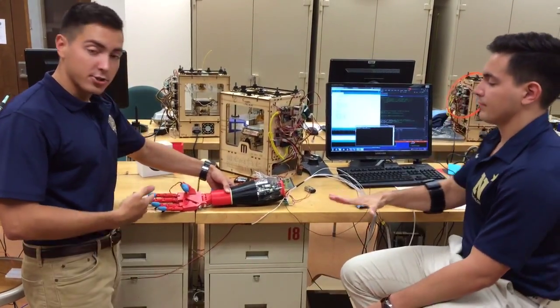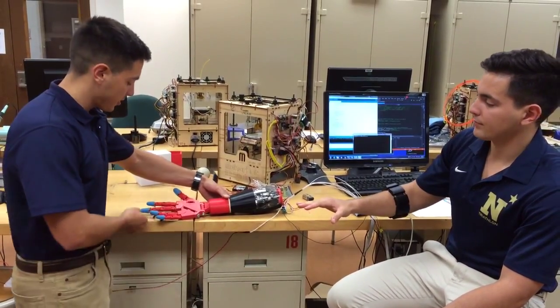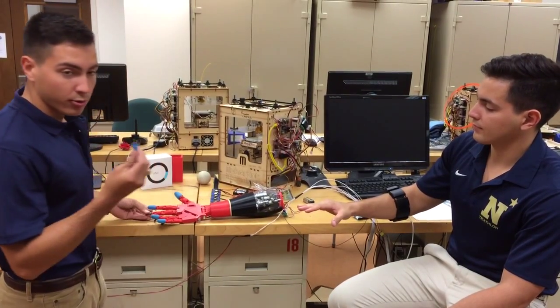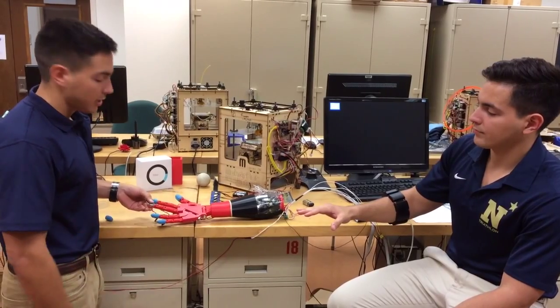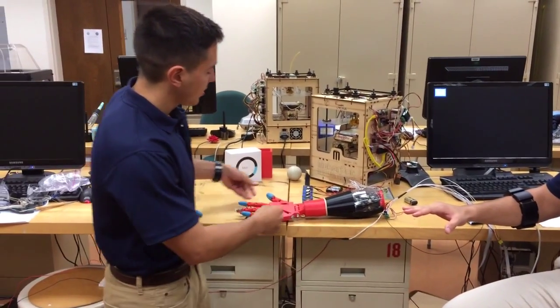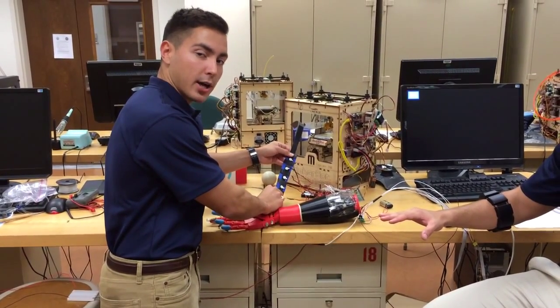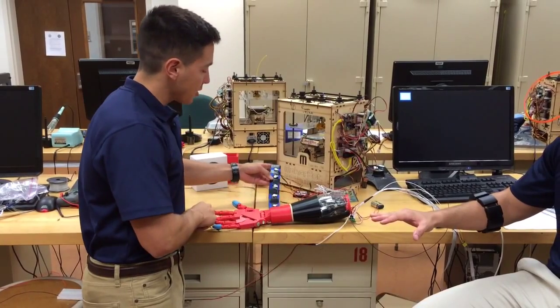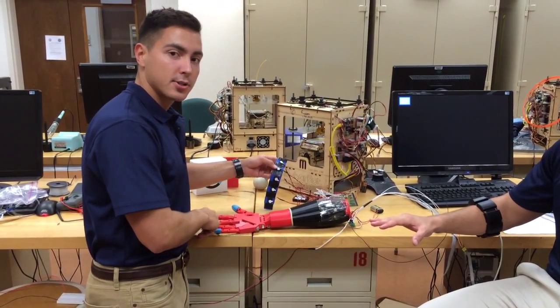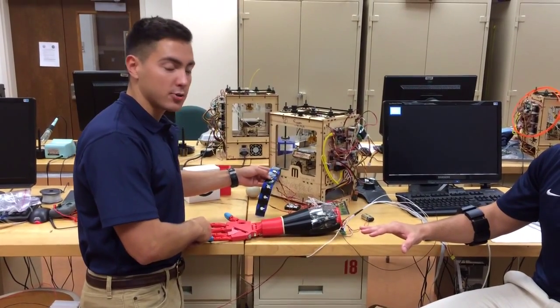An interesting feature of our prosthetic is that we're trying to give it haptic feedback, which is vibration feedback to the user. Below these blue rubberized fingertips there are four sensors. These four sensors are then sent to this armband, which is supposed to be used by the prosthetic, or the APT. The force is proportional to the amount of voltage applied to each of these motors, and thus proportional to the amount of sensation the user gets to feel.